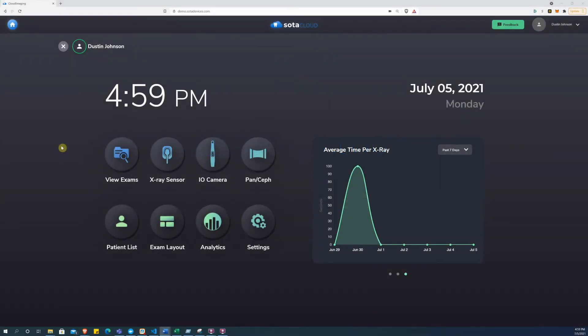To start, from the SOTA Cloud home view, select the type of exam you want to start and select a layout.